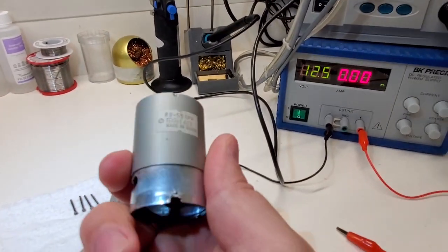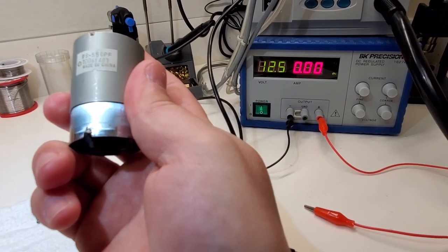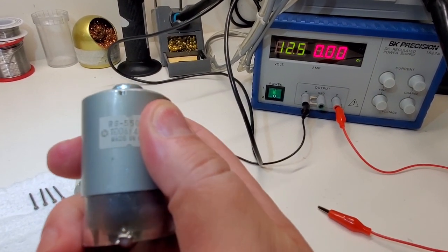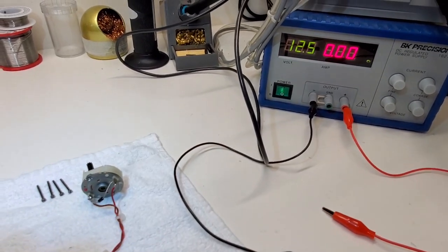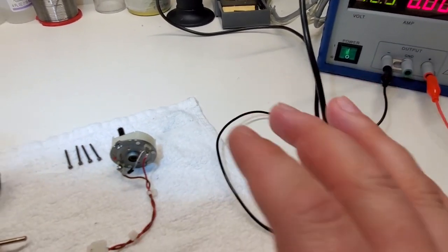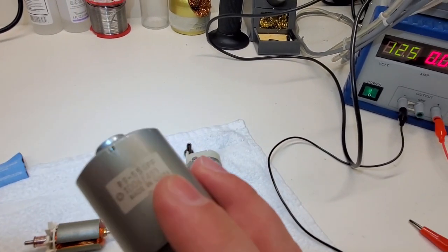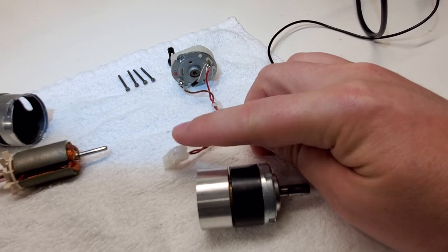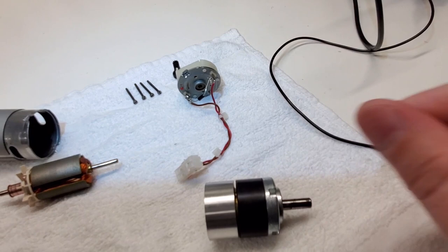And this motor, you can see it's an RS-550PF. Now, the PF doesn't necessarily matter when you're looking up a data sheet. You're going to look up the RS-550 and start from there. And if you can find a data sheet for the PF version, good for you. But often the last numerals on your part number are going to be for special options, like your type of wiring, your type of connector, and stuff like this little shunt diode right here.